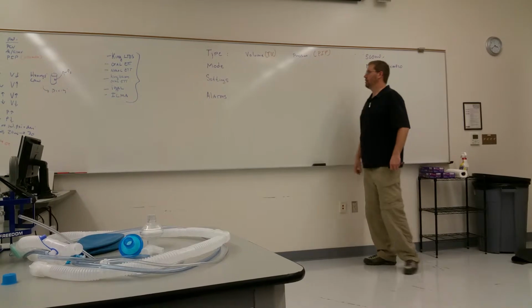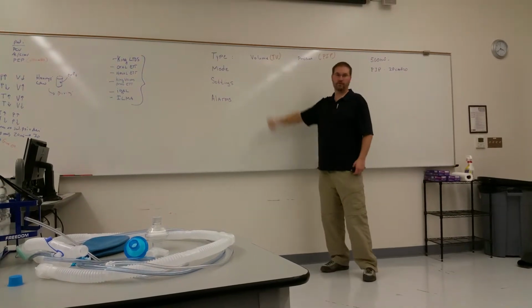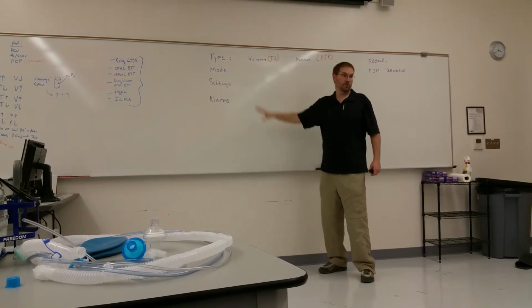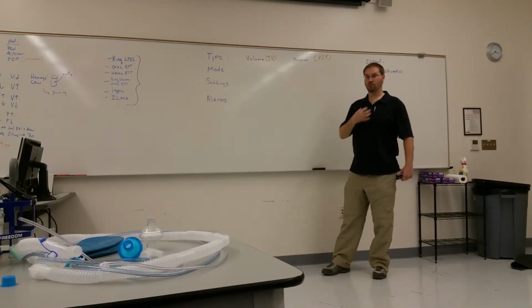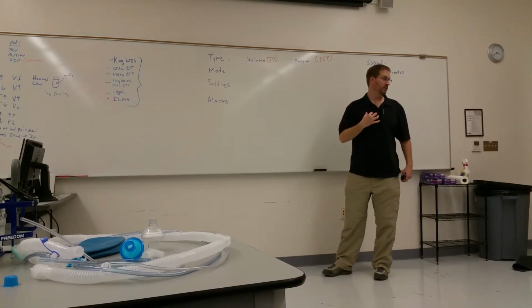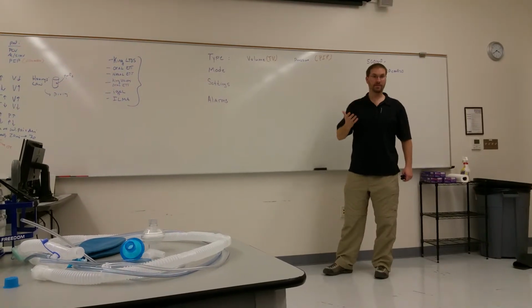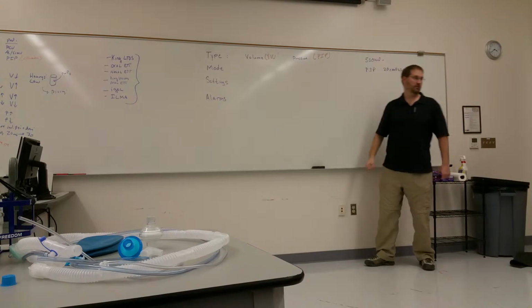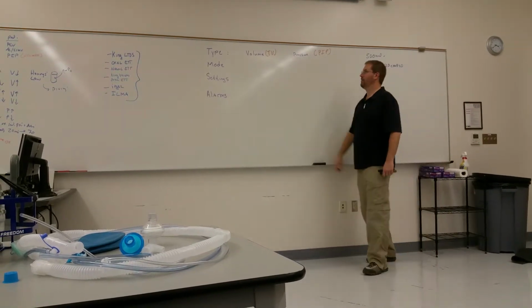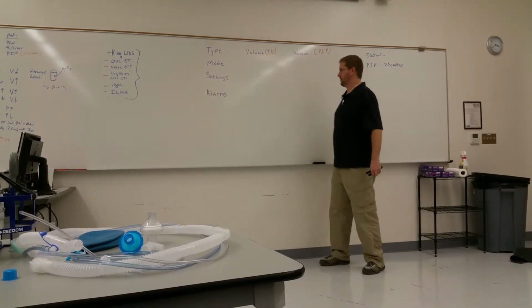So most adult patients do okay on volume control. Generally, we'll start with volume control. Pediatric patients, neonates, and patients that you're really worried about airway pressures, where you really want to limit the pressure in the airways and have direct control of that, pressure control is generally where to go. But as a rule of thumb, we do volume control.